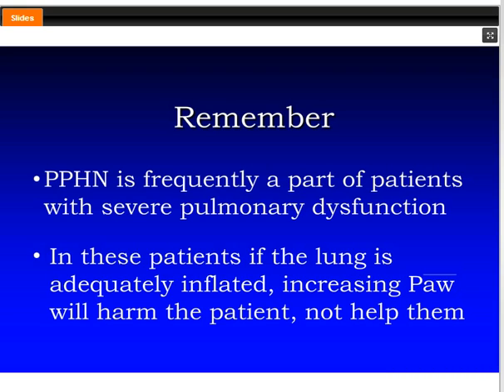Okay. You didn't mention flows. What are your thoughts on setting flows on the 3100? Well, the flow should be set so the device that keeps the mean airway pressure where you want it is between 10 o'clock and 2 o'clock. So that's where you want that set, and that's how you set your flow. Okay. So basically, you want your limit knob somewhere near the top to give you a broader range of turning it. Correct.